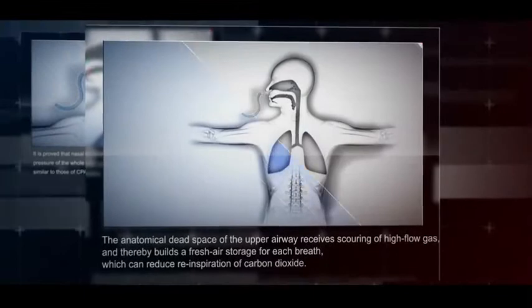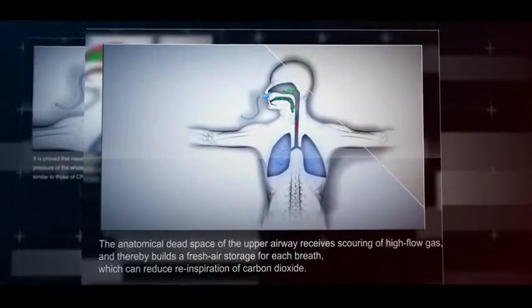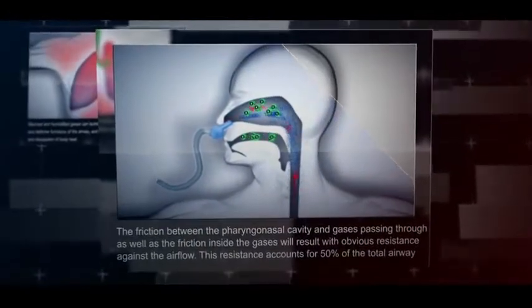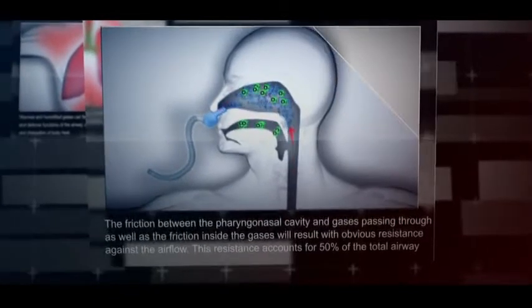The anatomical dead space of the upper airway receives scouring of high-flow gas, and thereby builds a fresh air storage for each breath, which can reduce re-inspiration of carbon dioxide. The friction between the pharyngonasal cavity and gases passing through, as well as the friction inside the gases, will result in obvious resistance against the airflow. This resistance accounts for 50% of the total airway resistance.